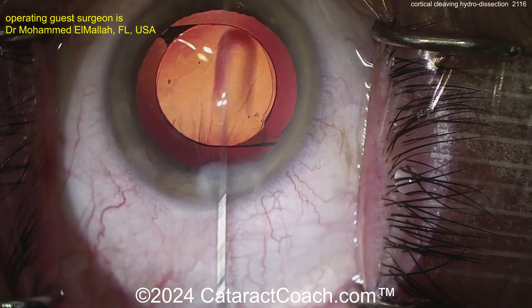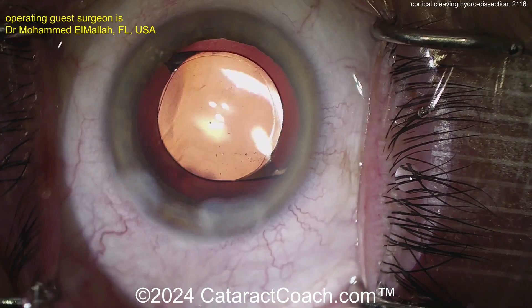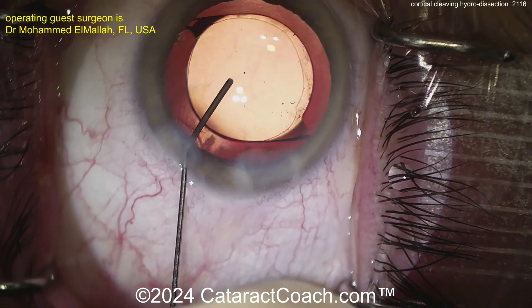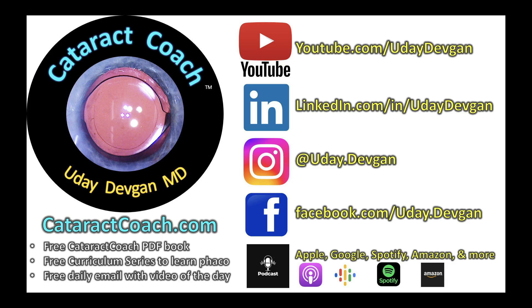That capsulorhexis is overlapping the optic nicely — a very skilled surgeon. Hydrating up the incisions, and that's the case. I want you to try Cortical Cleaving Hydrodissection — a neat technique described by Howard Fine. I'll send him an email today and ask him to be on our podcast. Check it out and you'll learn a lot.